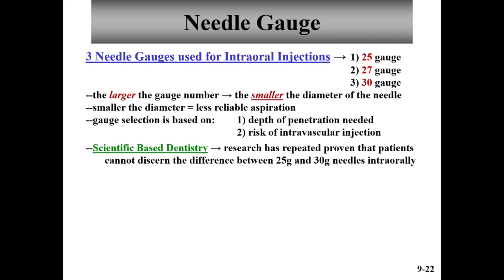That's not true with skin. Well, they're not going to use a 30 gauge, well, they could with diabetes. But with the smaller diameter, you don't feel as much on the skin as the larger diameter needles. But that is not true intraorally. Patients cannot feel the difference. So choose the gauge that you need based on what you're using that needle for, and don't think about patient comfort.